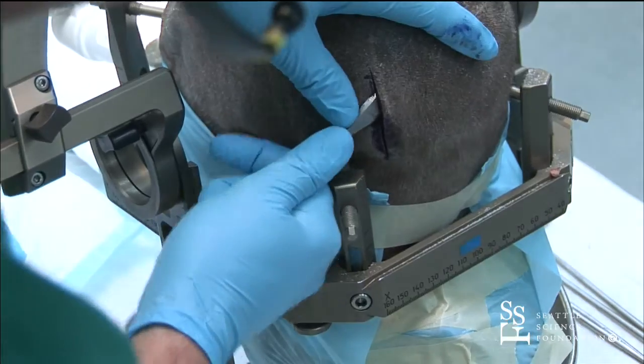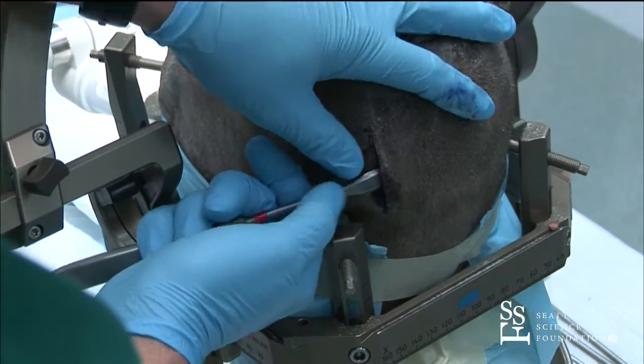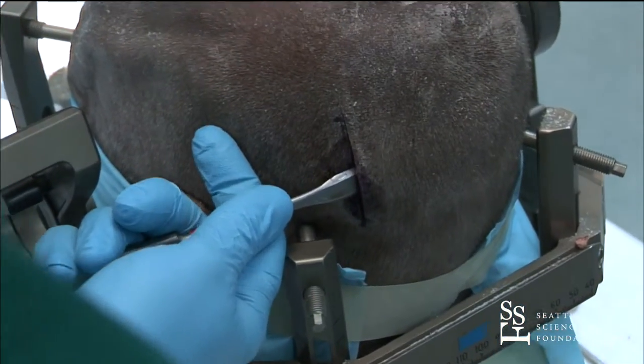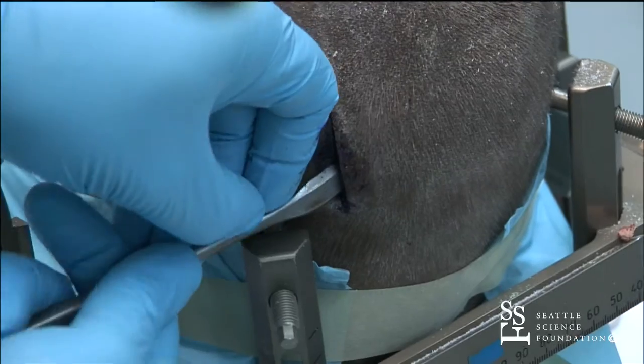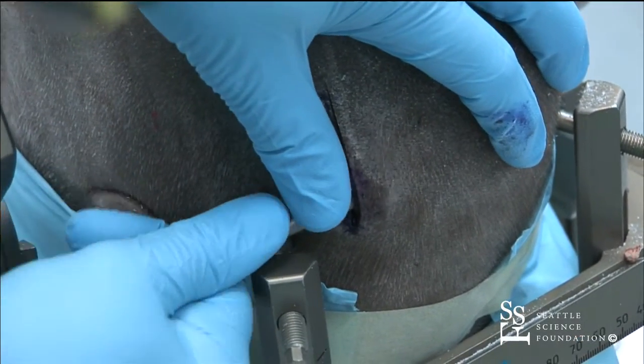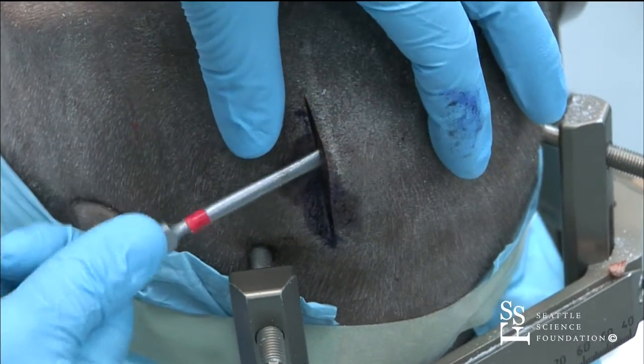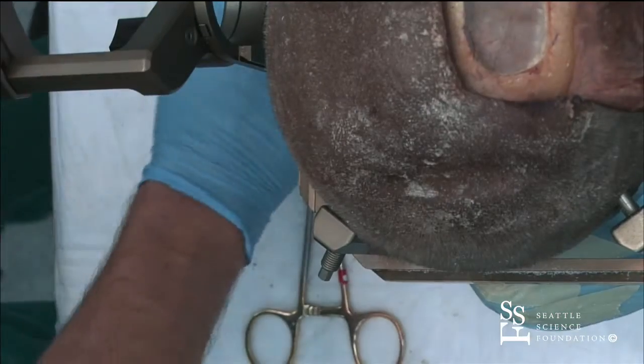And oftentimes I'll tunnel an area underneath the skin afterwards. We've already opened up the cranium here, but we typically do the depth electrode placement first, just to make sure there's no air that gets intracranially and allow us to have a more accurate placement.